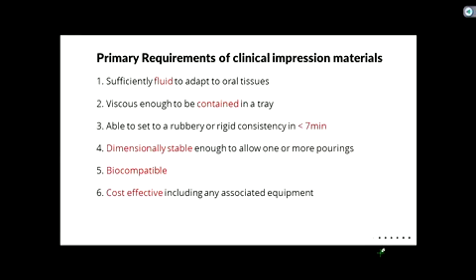We have a few things that we want to look for that make for a good impression material. Sufficiently fluid to adapt to oral tissues. What's the point that we're trying to get across here? Sufficiently fluid, to get the details.